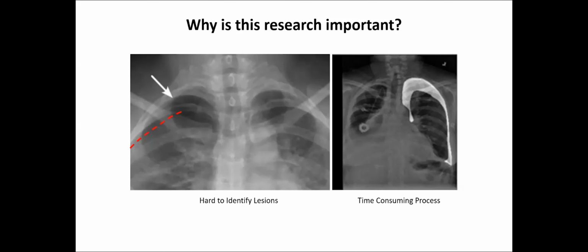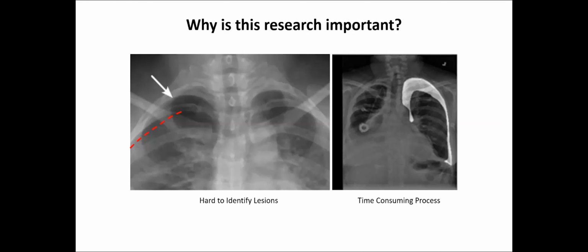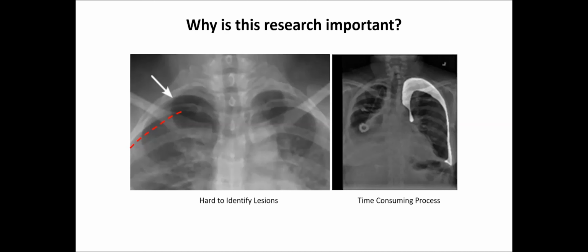They have to switch between the actual X-ray and, if they have already labeled the lesions, they need to flip between those slides to confirm where exactly the lesion is happening. So it's a very time-consuming process.